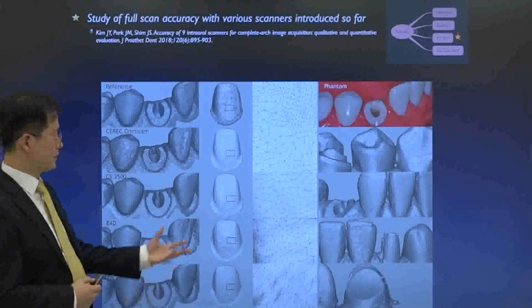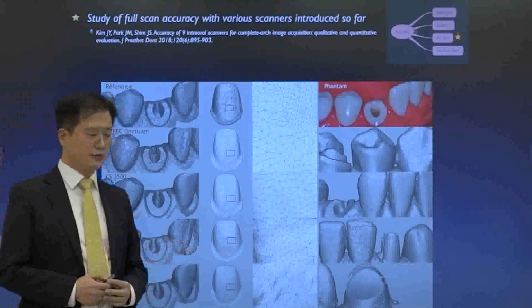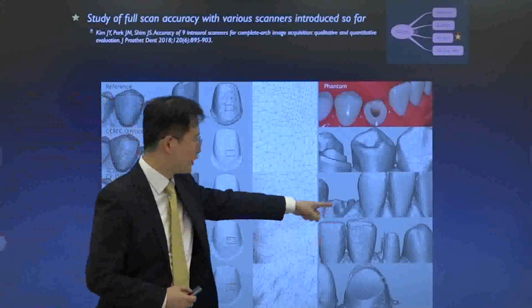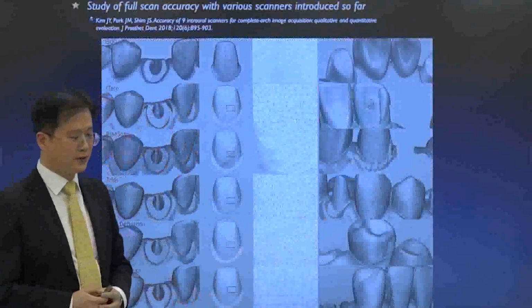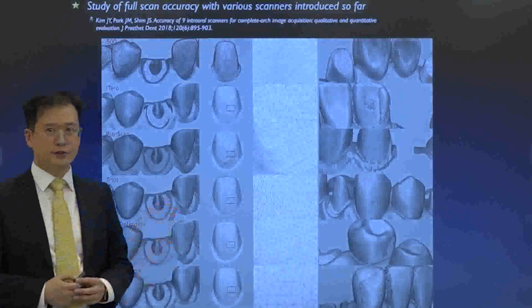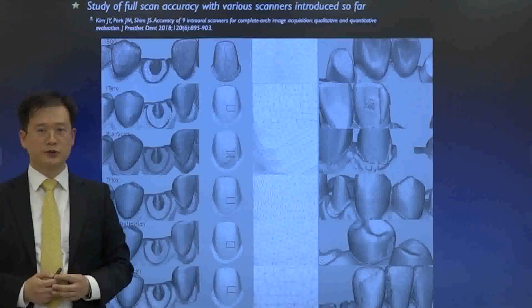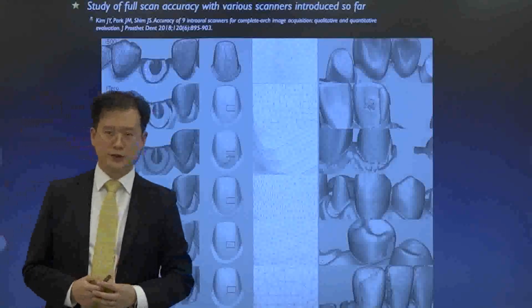We can see the deformations in the real impression body made from rubber impression material. Also, we can see the errors made by intraoral scanner systems. Therefore, when the clinician makes a digital impression with an intraoral scanner, he or she must check the digital impression data before transferring it to the design center.